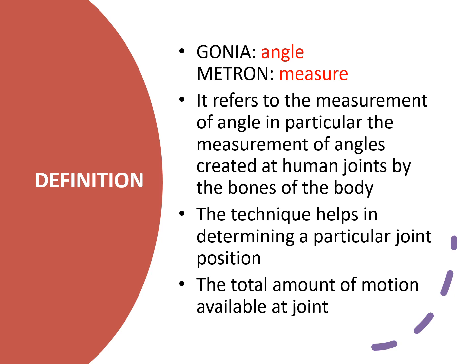So how do we come to know it is 180 degrees? How did we assess that there is 180 degrees of movement available at the shoulder joint? That is because we have an instrument known as a goniometer. We use that instrument and measure how much movement is available at a particular joint.